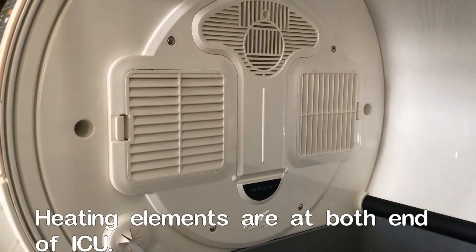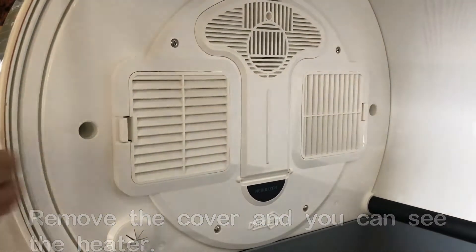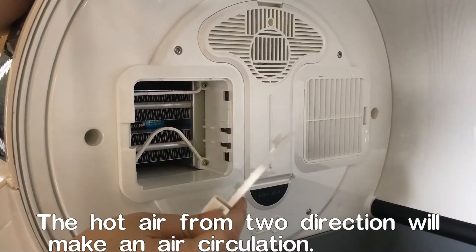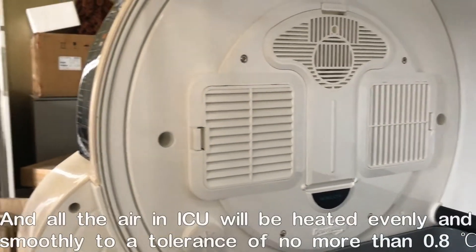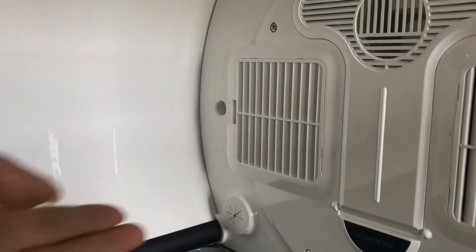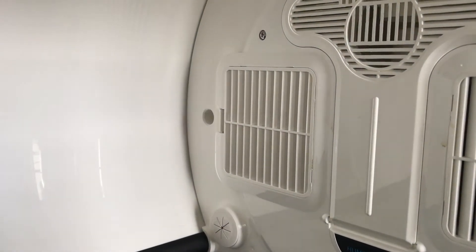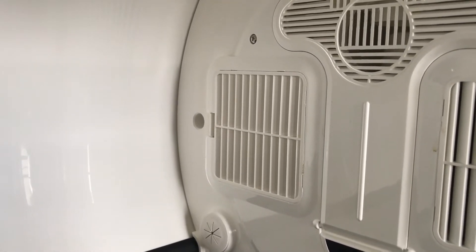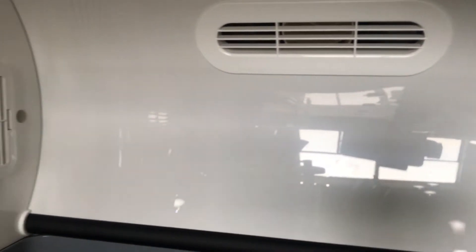On both ends of the internal compartment you can see there's a square opening. When you open that, it's showing you the heating element and the ventilation fan on the back. One is at the front left corner, the other one is at the right rear corner. This forms a recirculating system of hot air that distributes all the heat evenly and smoothly into the whole environment.